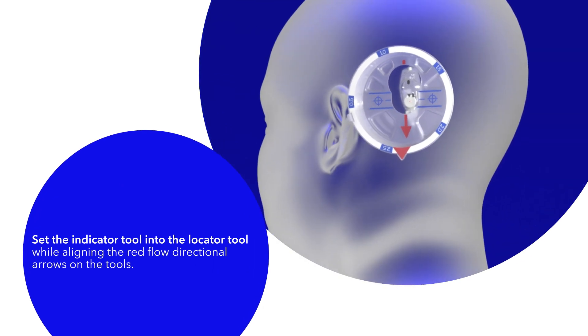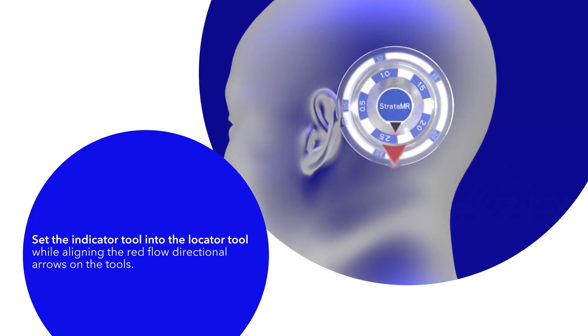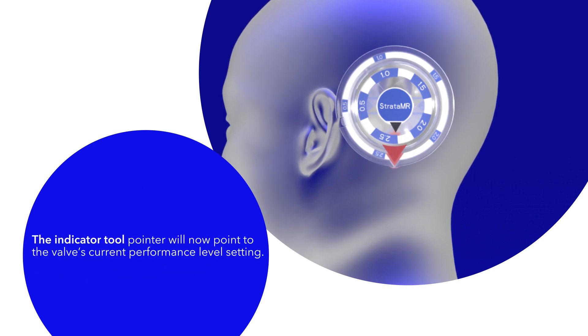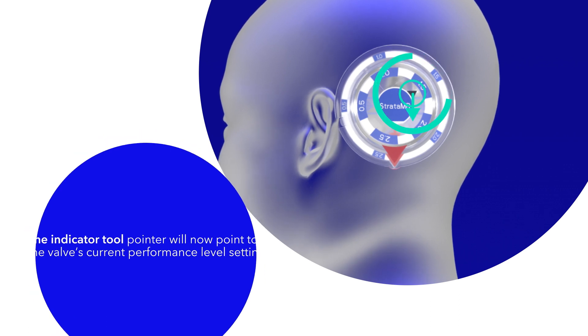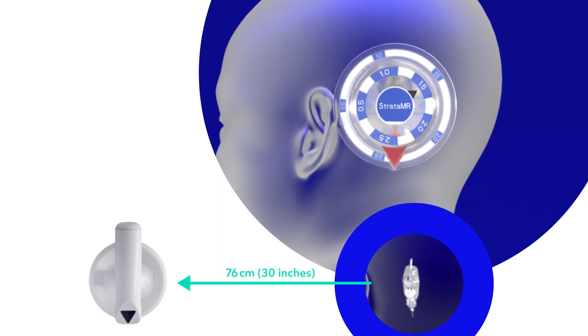Set the indicator tool into the locator tool while aligning the red flow directional arrows on the tools. The indicator tool pointer will now point to the valve's current performance level setting. Ensure that the adjustment tool is at least 76 centimeters or 30 inches away from the valve to avoid influencing the readings.